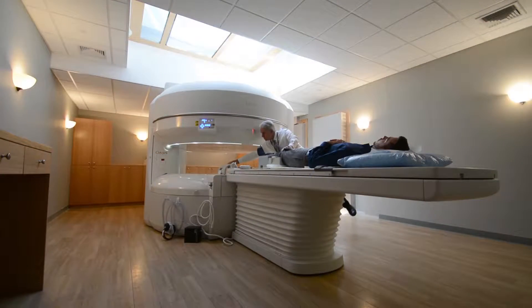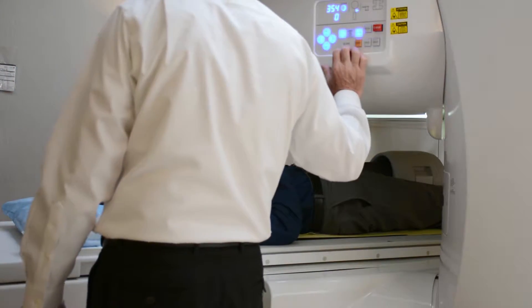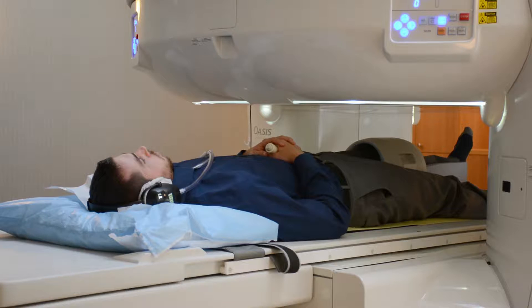That's what coils are — depending on the specific body part. For example, for a knee, we would have a coil that would take a picture of your knee. If we were going to take a picture of your foot or your ankle, that would be a foot or ankle coil that would only be able to take pictures of your foot or your ankle.